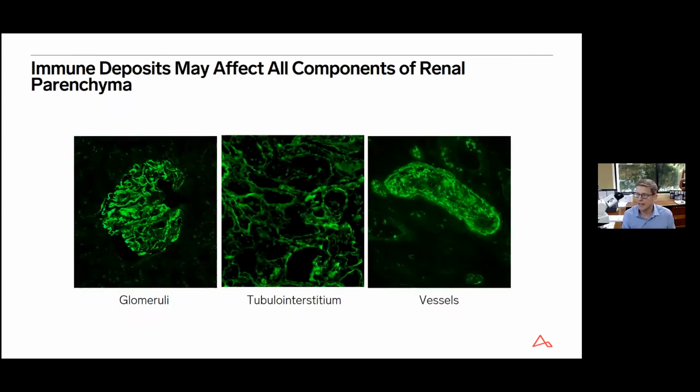You see nothing. Here are some examples of positive. When they're positive, in this case, there's a specific fluorophore that emits a green color. So when it's positive, you can see that fluorophore. Again, bright green here, and you know what's being tested for. So you know this antibody was for, say, IgG. From this, we can determine both the type of protein that's present, as well as the location of this inflammatory protein. Here's a glomerulus staining positive.